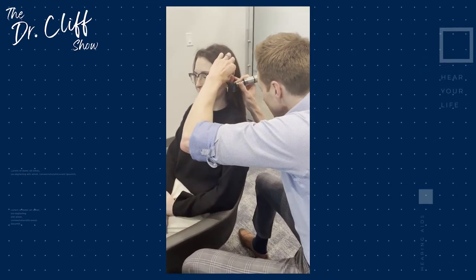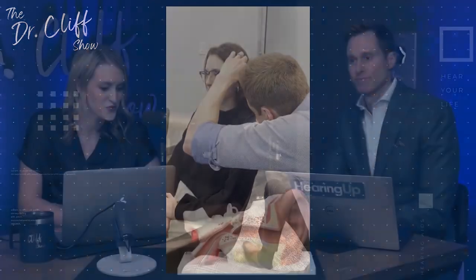However, there are some drawbacks to this type of approach. So first and foremost, you end up with a pretty limited view, right? So if you saw in that video, he's got to get all the way up to the ear there. You've got to close one eye if you can, and really kind of look, and what you're looking in at is this teeny tiny little circle, and kind of moving it around to visualize all of the features of the ear canal.